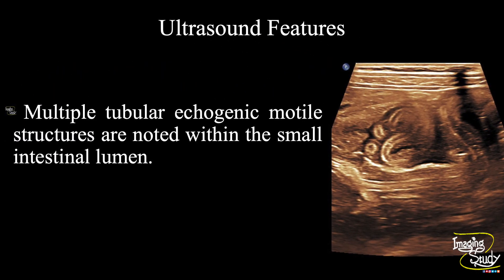So in summary, multiple tubular echogenic motile structures are noted within the small intestinal lumen, suggesting this as a case of intestinal ascariasis.